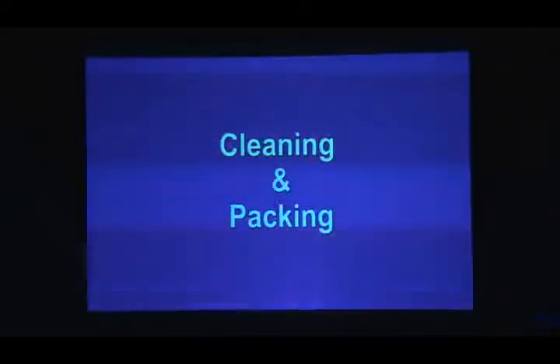If you are commencing an OT, at that time fogging is required or not? No. Fogging is not required. While commencing also? Yeah. Because if you are cleaning and disinfecting the surfaces, as we have shown, every day, then on the morning of the day, you don't have to fog it. No, he's asking about a new OT being opened for the first time.